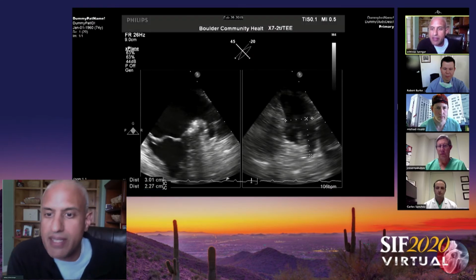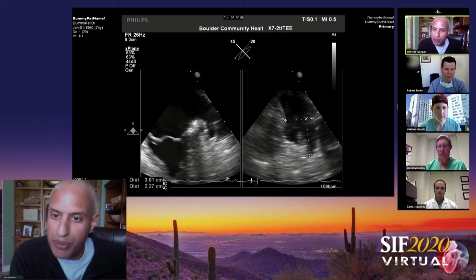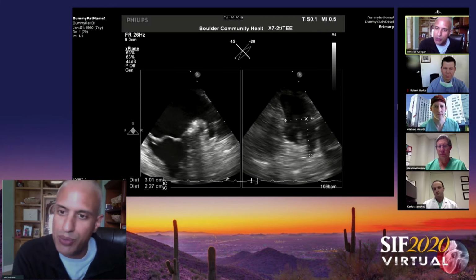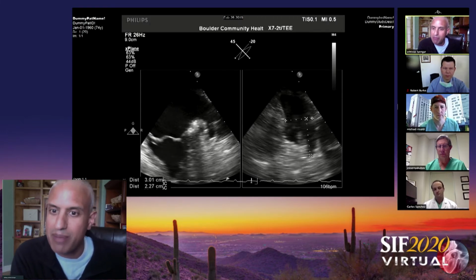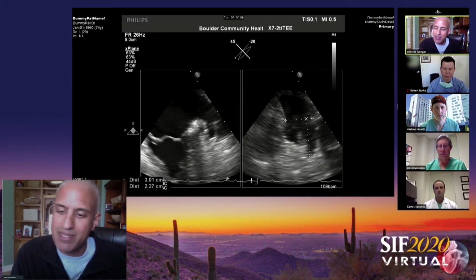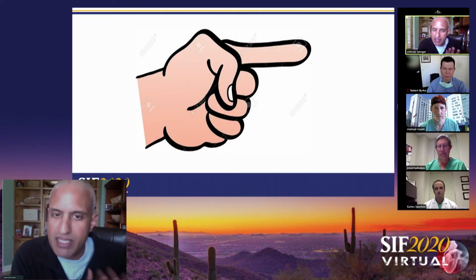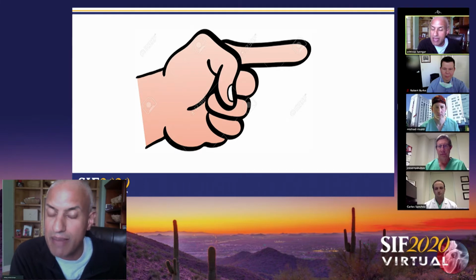You can see here on the TE where the measurement was done pre, by numbers, this is adequate for placement of a device. But by visualization, we can all tell it doesn't necessarily mean you can put a device that deep into the lobe, knowing full well that it might be too thin to place a device. I'd like to point that out because this is pretty much what I thought we were dealing with in this case. That finger being the pointer where we were actually seeing the depth, and the knuckles being the rest of the lobe.